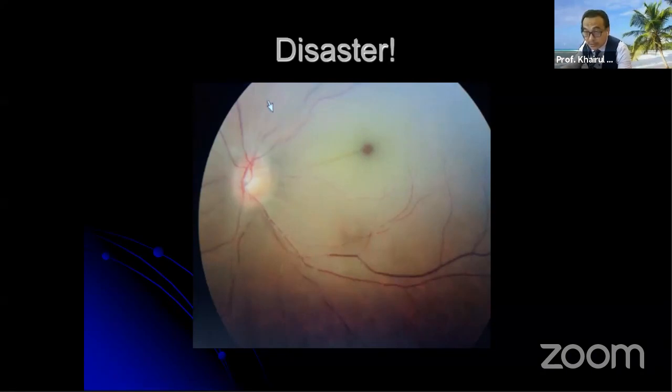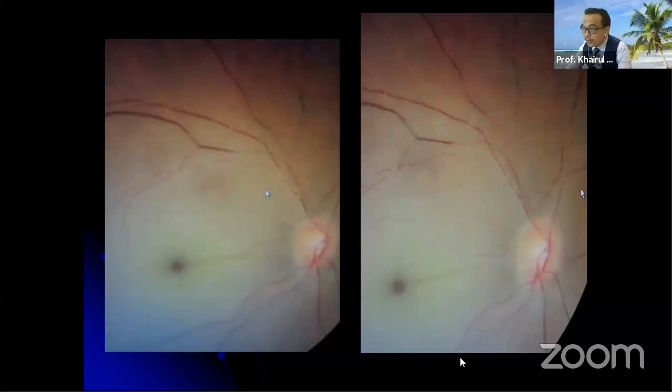Maybe also some of the effects that I mentioned, the three things, that is how it can happen. So in the future, if you see this kind of meningo-ophthalmic branch, I advise not to use particles, just maybe put in a coil. Our principle is just to reduce intraoperative bleeding rather than cure the lesion. You see the particle here, and this can cause you a medico-legal complication.